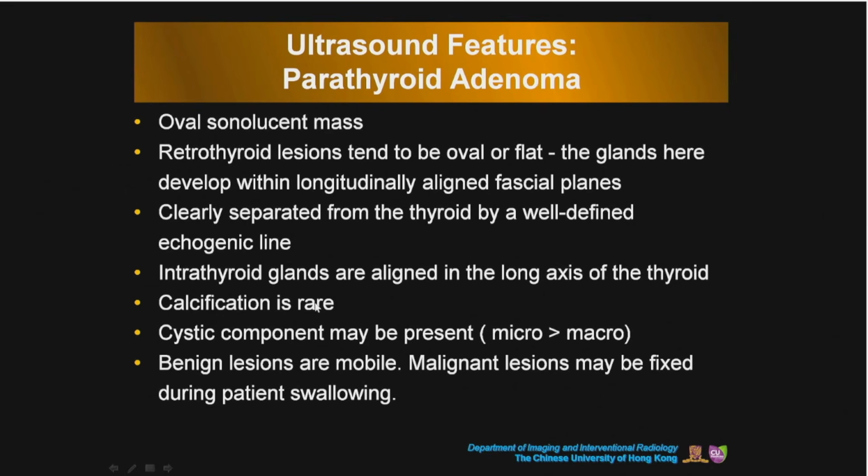Calcification is quite uncommon, though cystic component is often present. As the gland becomes bigger and bigger, it undergoes necrosis, so the cystic component is actually quite often present. And it is separated from the thyroid by this well-defined echogenic line.